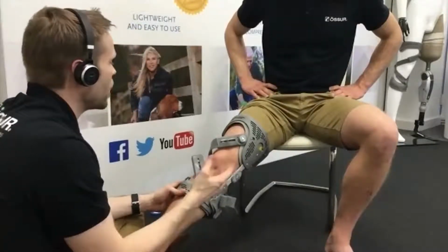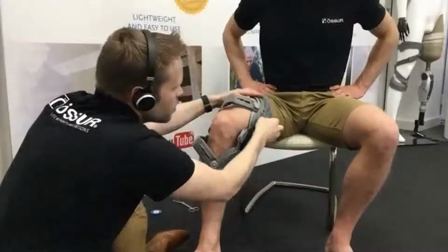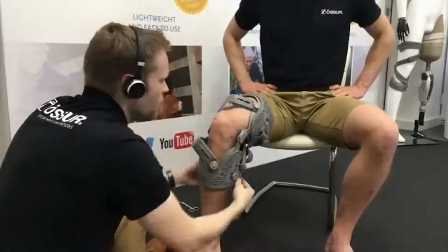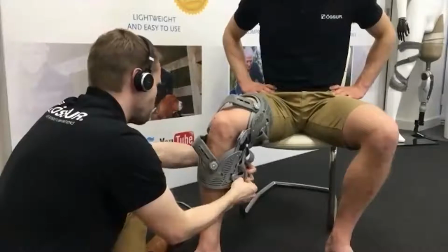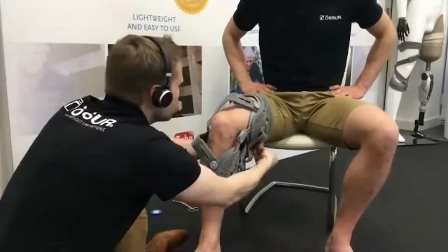Either side. Next, when we go to fasten the top, we're going to bend the knee, okay, and pass this one round. And what we're just going to do is fasten this yellow on yellow, clip that one into position, and I'm just going to tighten both these horizontal straps first of all. Okay, so you can trim these if needed, but I'm just fastening these into position.